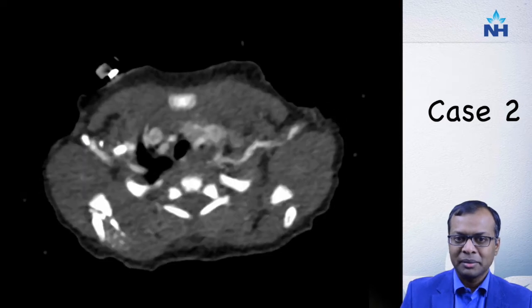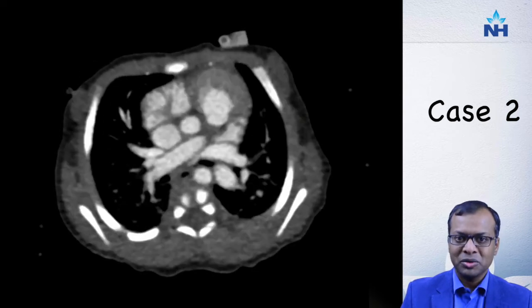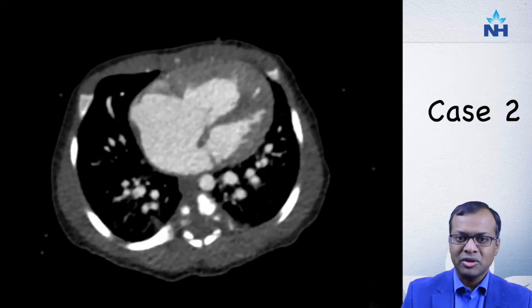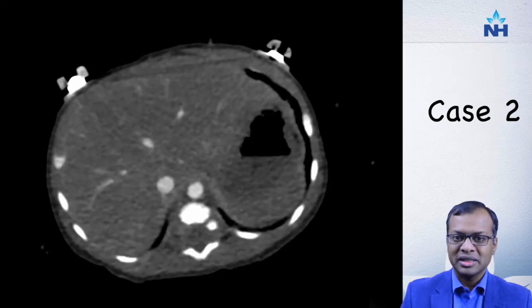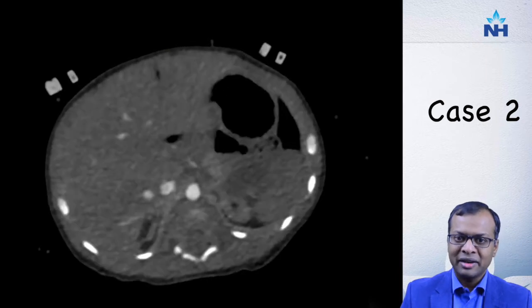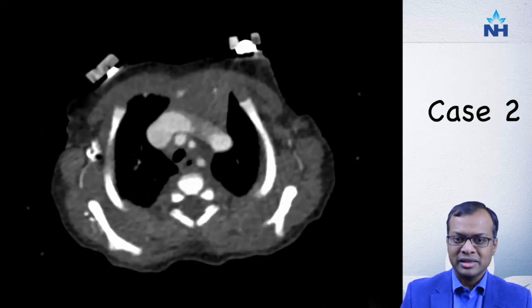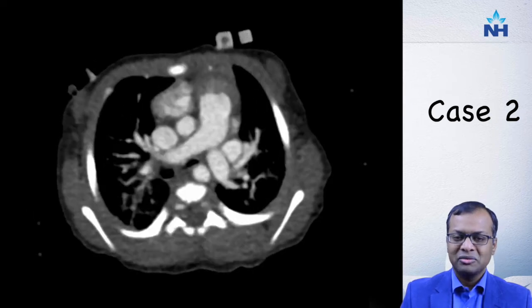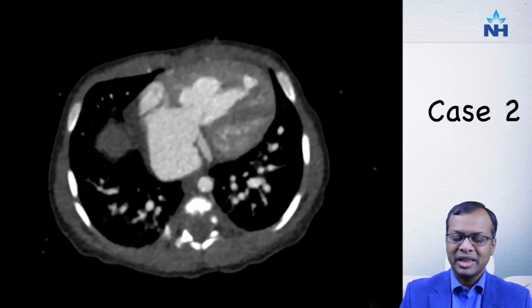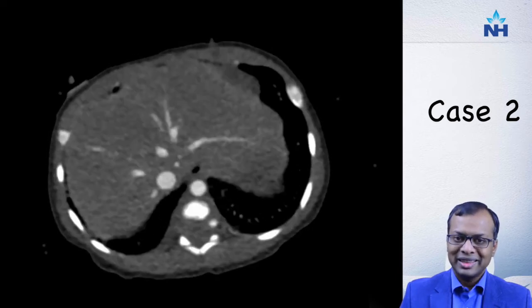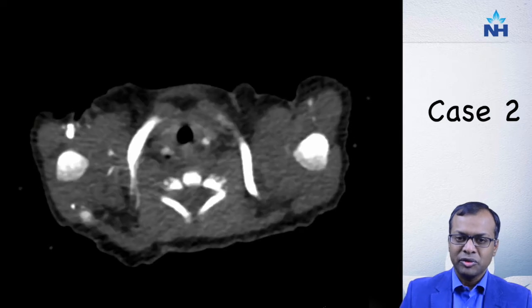Now let us look at case number two. I'm going to let it run a couple of times so you get acquainted with the pathology. Again our standard technique is one ECG-gated run and one non-ECG gated run so we can see the coronary arteries clearly. Remember the approach: look for abdominal situs, systemic venous return, ventricular relationship, pulmonary venous connection, the aorta, pulmonary arteries, and coronary arteries before making up your mind.